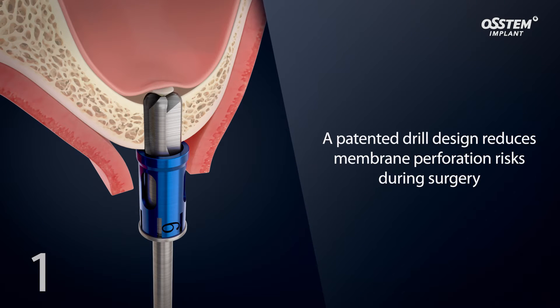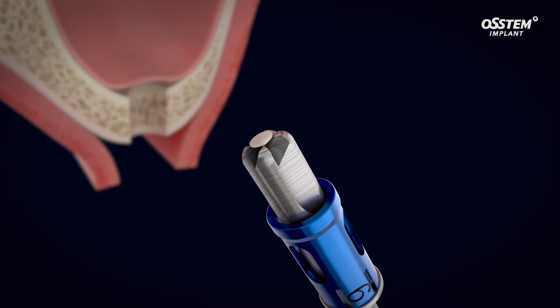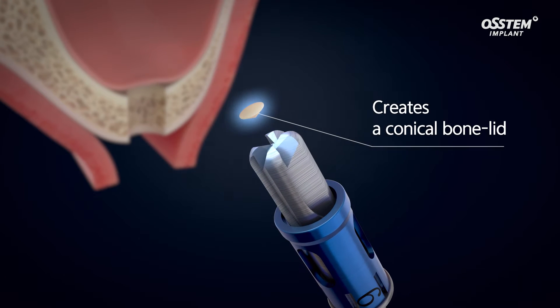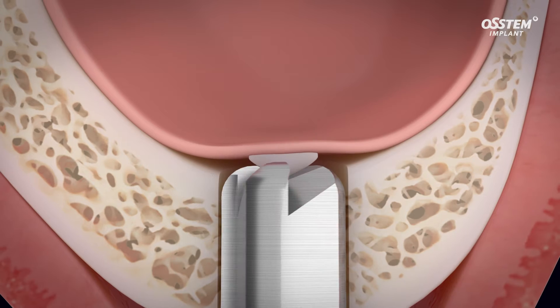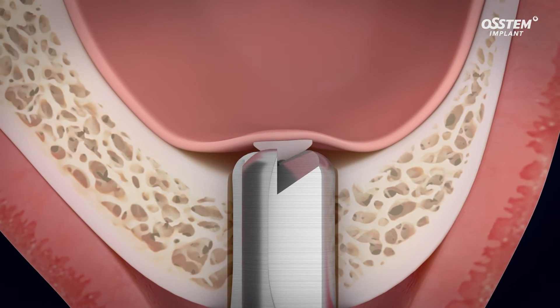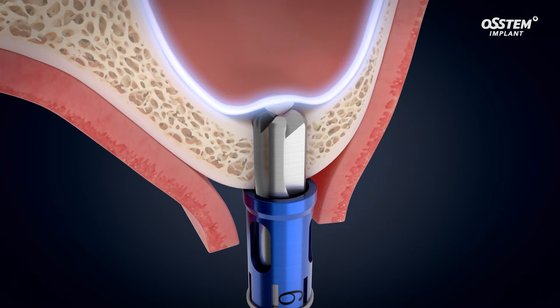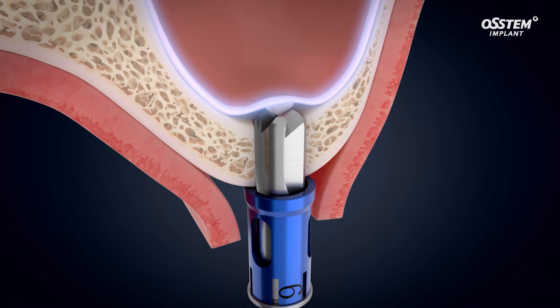The CAS kit reduces the chance of membrane perforation. The patented CAS drill creates a conical bone lid that keeps the drill edge from direct contact with the membrane, ensuring safer drilling by preventing sinus membrane perforation.